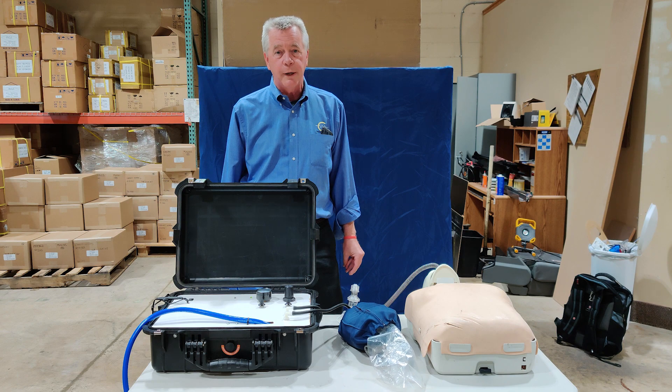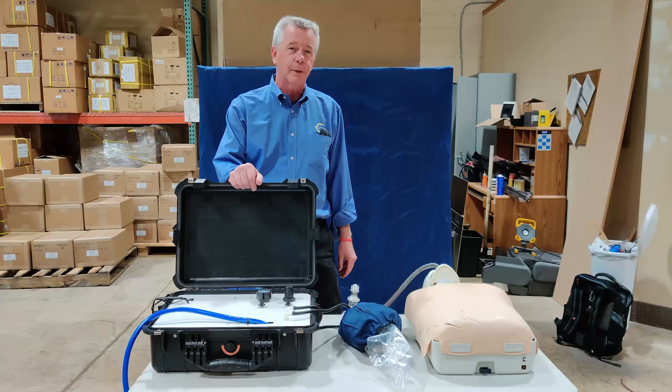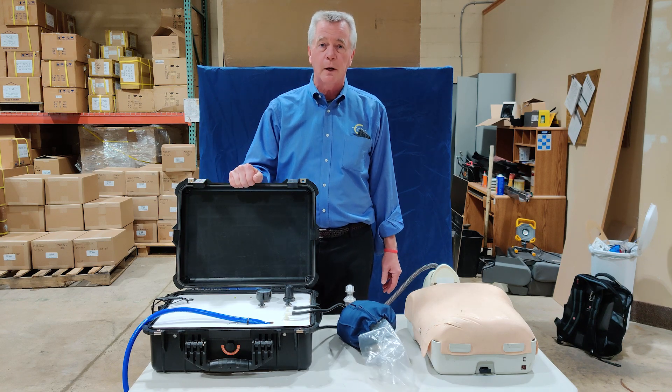We are looking at this point to decide if we move forward with production. We expect that this can be built with less than $200 in parts and they can be built pretty quickly. We actually have a manufacturer up in New York State who is ready to go.